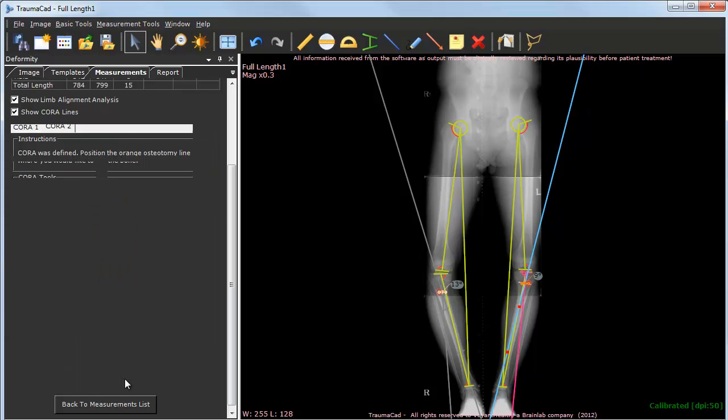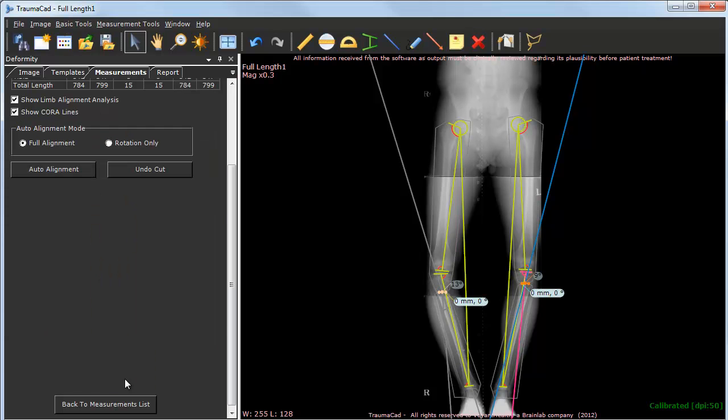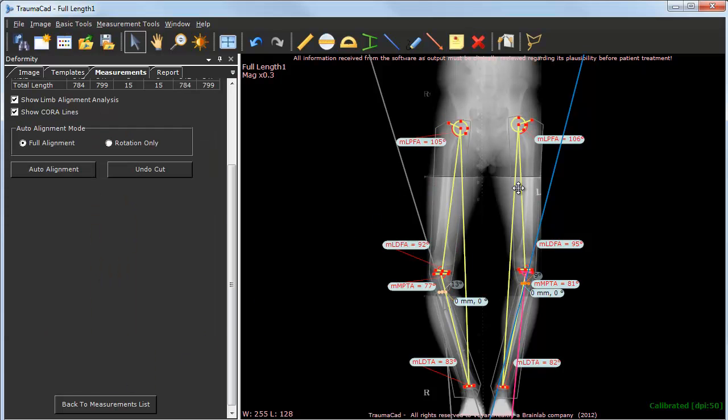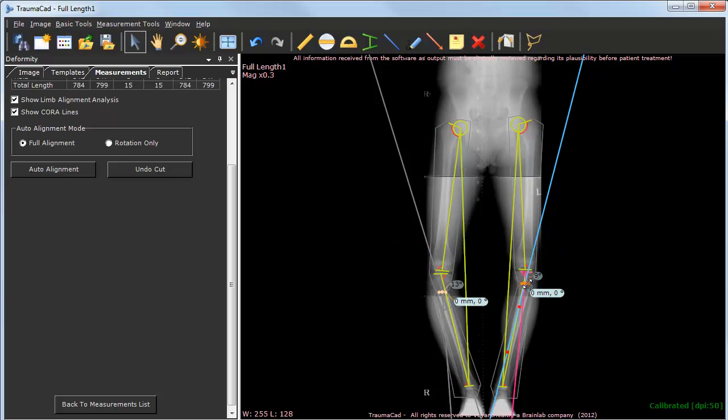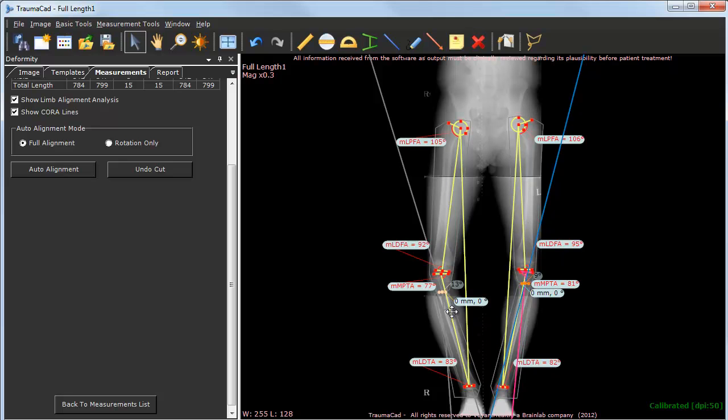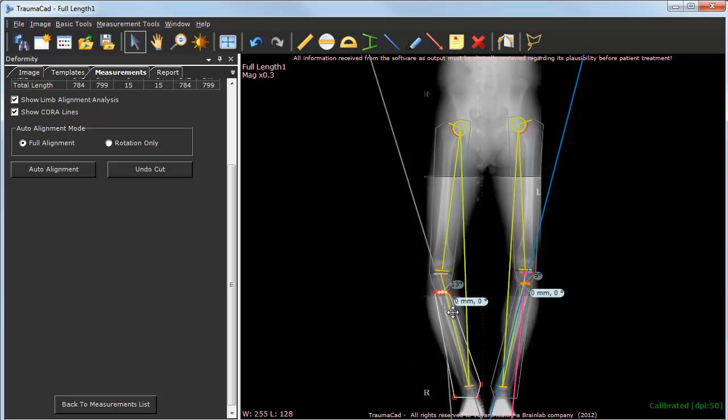Click the Finish and Cut button to simulate the osteotomies. The application automatically detects the anatomical regions in the image and defines fragments surrounding the bones according to the suggested osteotomy line.